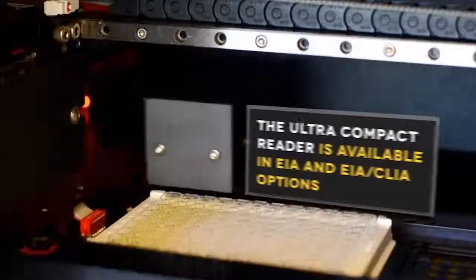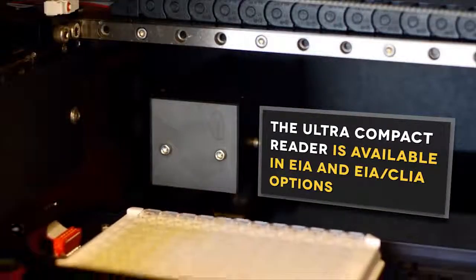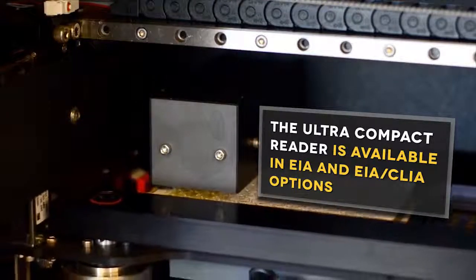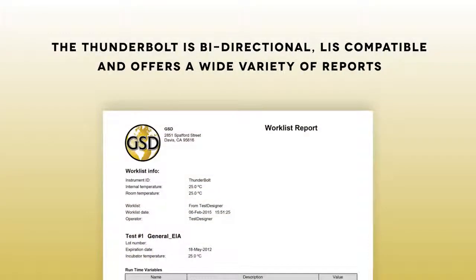The ultra-compact, built-in reader is available in absorbance only and absorbance plus chemiluminescence options. The Thunderbolt is bi-directional, LIS compatible, and offers a wide variety of reports.